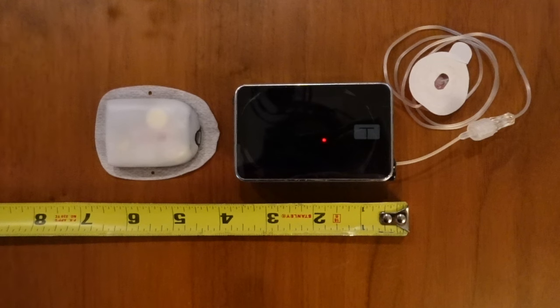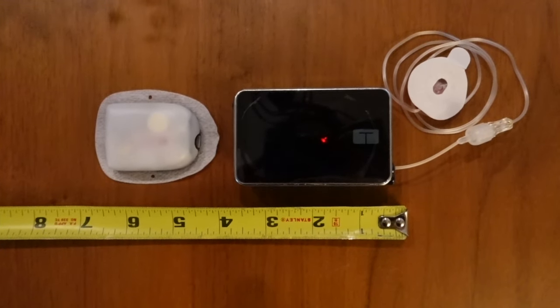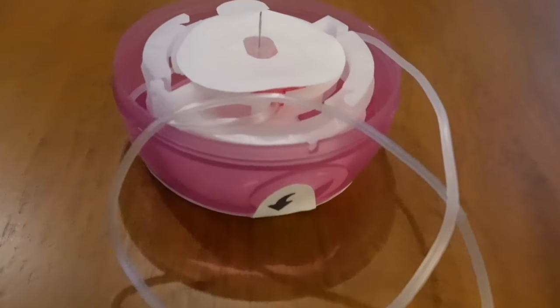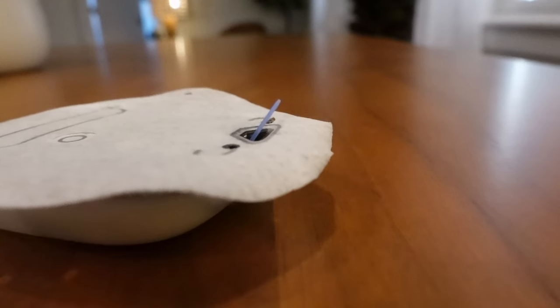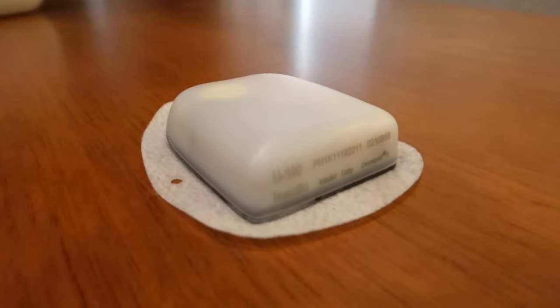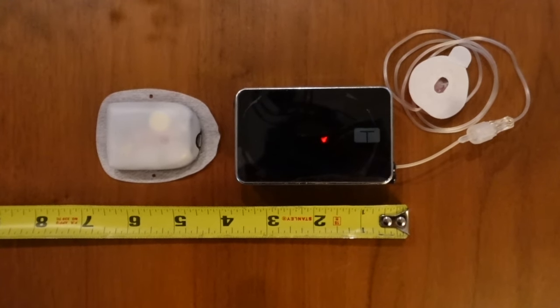The big difference between these two pumps is the T-Slim X2 is a tubed pump and the Omnipod 5 is a tubeless pump. The T-Slim X2 is approved for ages 6+, the Omnipod 5 for ages 2+. The T-Slim X2 holds up to 300 units of insulin, the Omnipod 5 holds 200 units, and both are approved for use only with U100 insulin. The T-Slim X2 has five different infusion set types — plastic cannula, steel cannula, different tubing lengths — while with the Omnipod 5, everything is built into the pod, so there's no customization of cannula type or material.